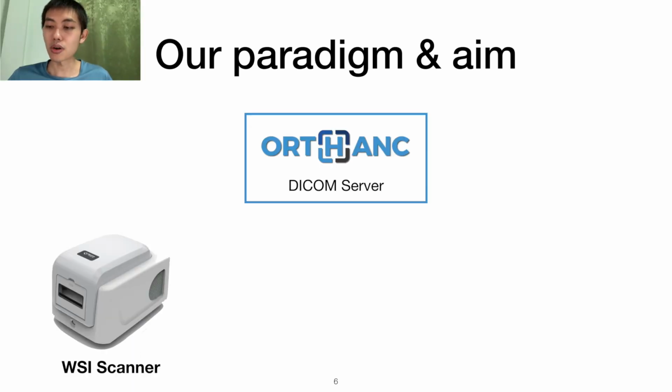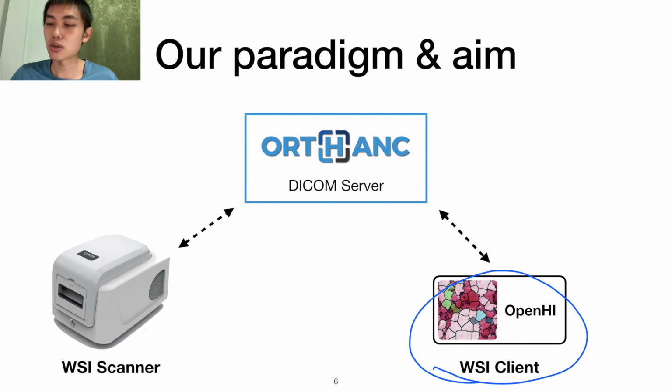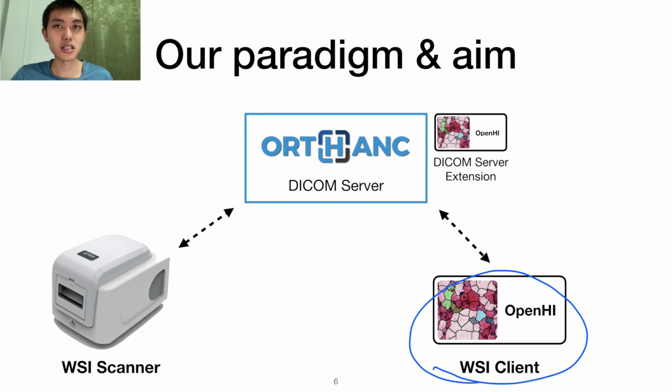So here's our view. We see OpenHI as the whole slide image client, and it would connect to everything using a standardized protocol and file format like DICOM and PACS. OpenHI could reside in the server as the DICOM server extension to help with additional processing and analysis.